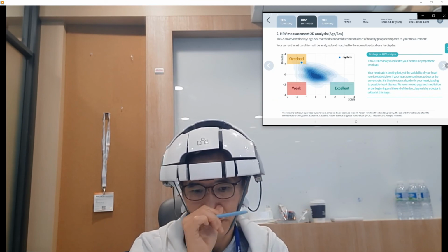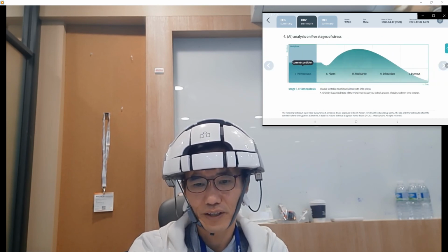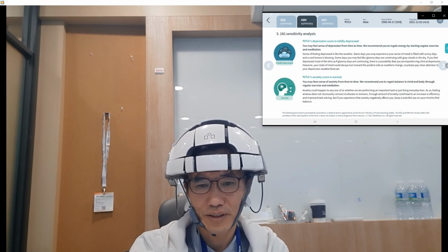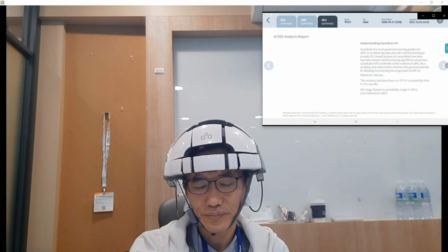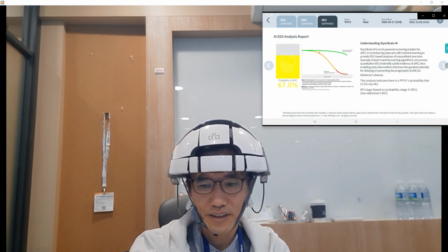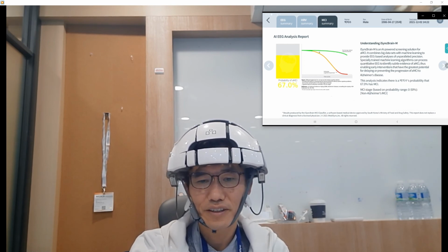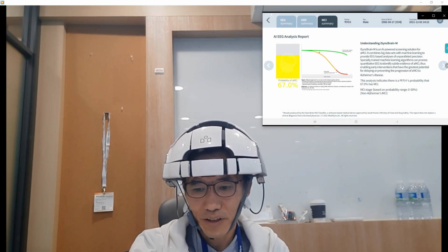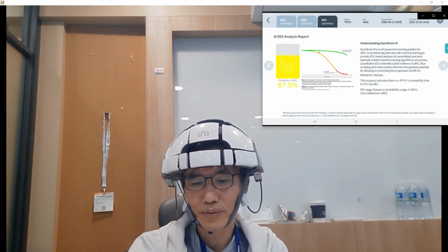You can find the 5 stages of stress model. You can also find the depression or anxiety score using the HRV scale. You can also find the MCI probability using our biomarker analysis. This is the quick explanation of the QEEG, HRV, and MCI summary. And within 10 minutes, you can find your own data result in this result management page.